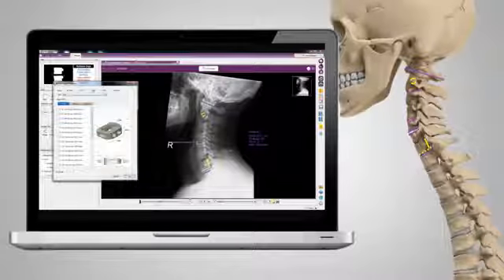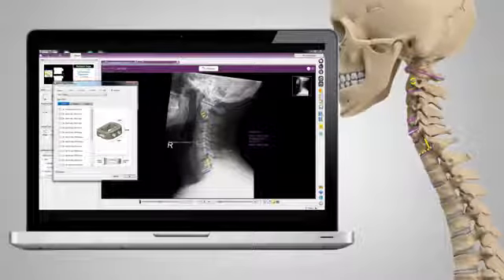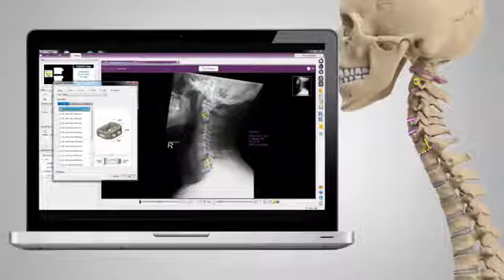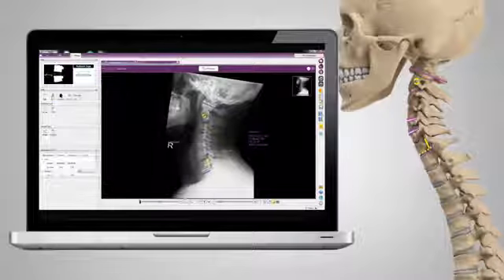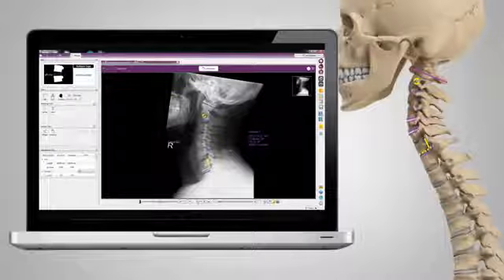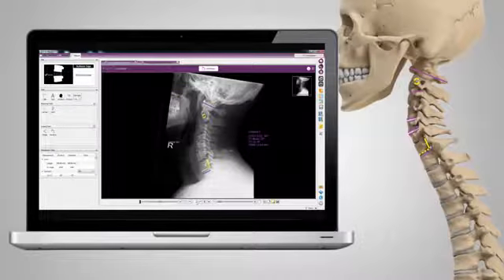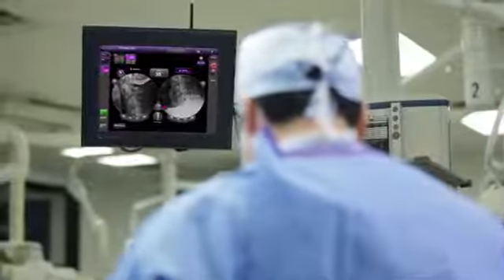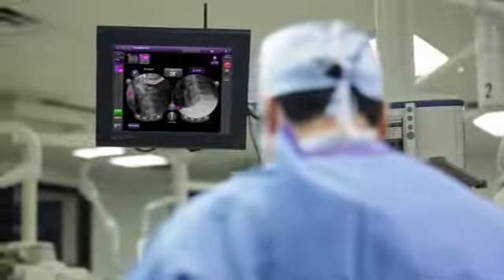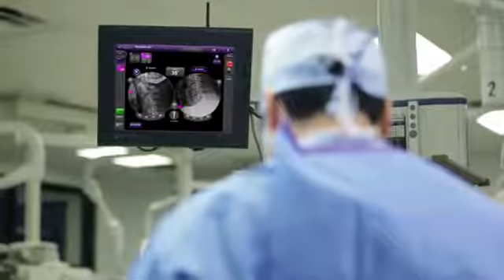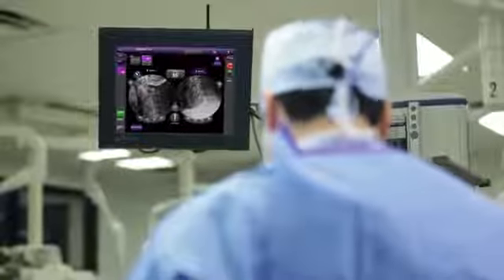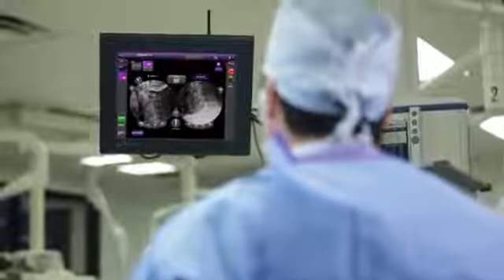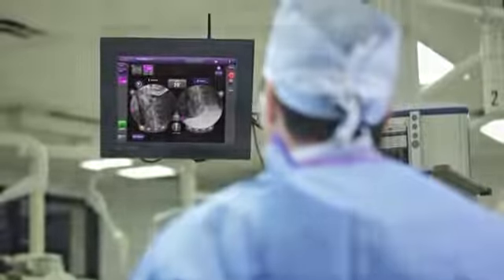Discover possibilities. Calculate options and assess solutions, all from a patient's radiograph. Once a plan is in place, monitor real-time alignment correction during surgery, regardless of your approach.